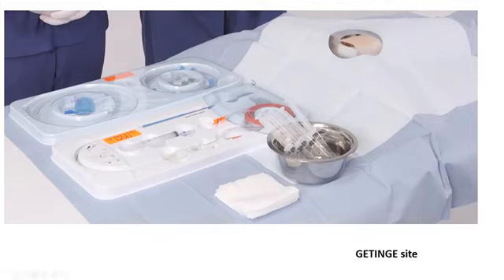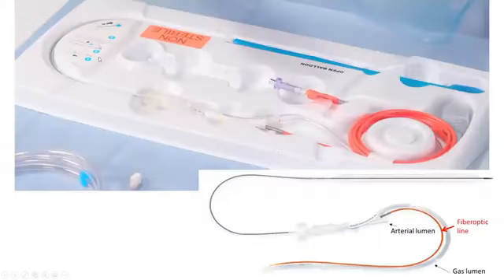The balloon pump comes with 2 trays. This is the first tray, which has the balloon pump catheter that I explained earlier with the 3 lumen, arterial lumen, helium gas lumen, and fiber optic line. And it's very easy to prep. The balloon itself is covered with that blue plastic, and you should leave it on until you're ready to advance the balloon pump, just so that you don't unfurl the balloon. So we leave it on.